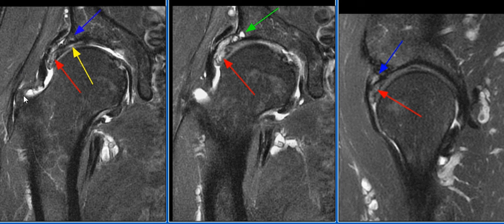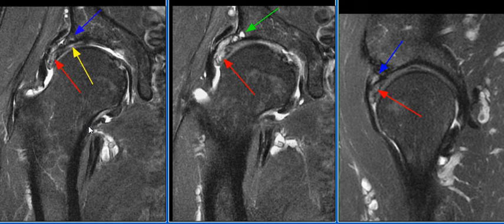There is mild tendinosis of the gluteus medius and minimus muscles along with edema in the subgluteus minimus and medius bursa. Also noted is tendinosis of the common hamstring origin.